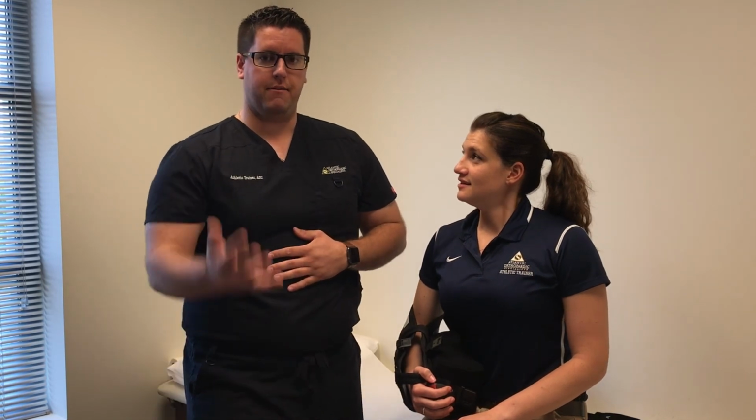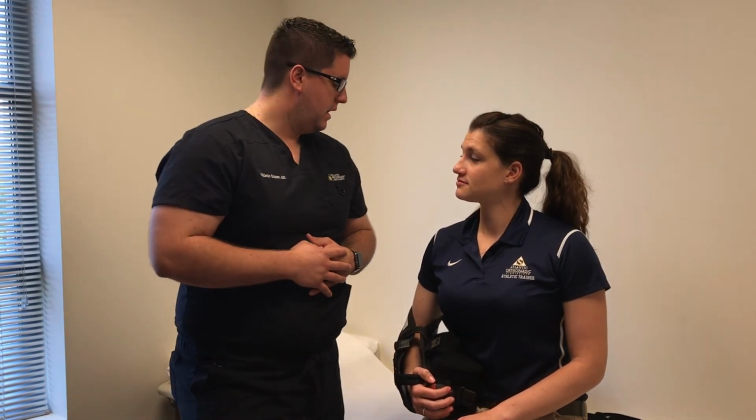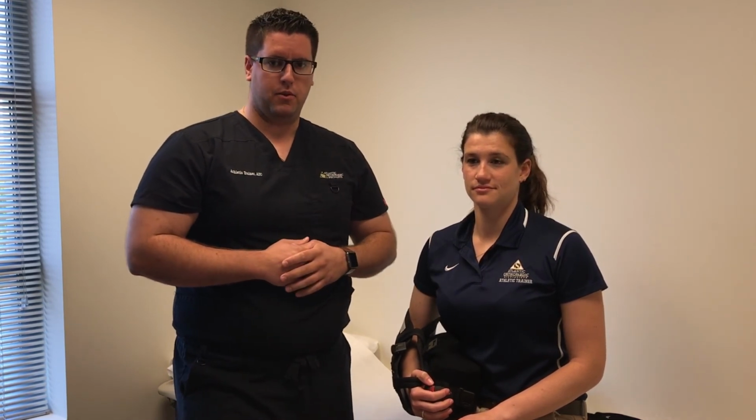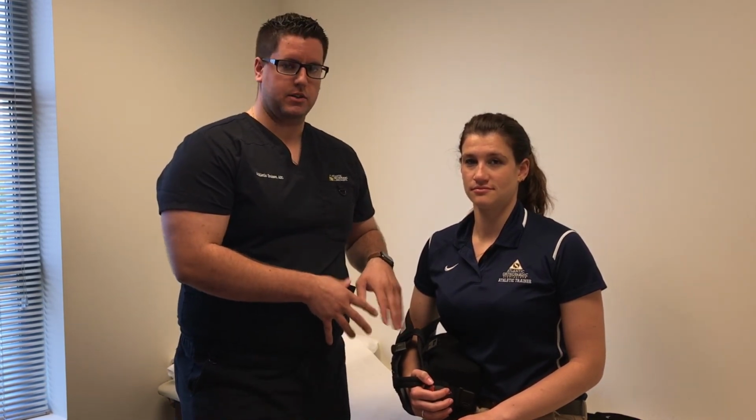When you do take your sling off, always make sure your arm's supported. Don't let it hang down to the side, for our rotator cuff patients out there. And then putting it back on again is very simple, just like a backpack. Put the good arm through last, bad arm in the sling first.